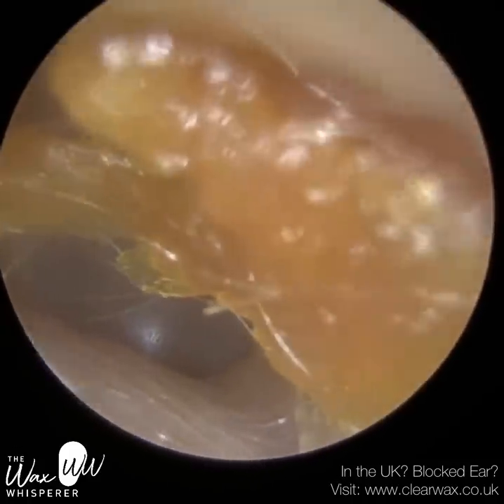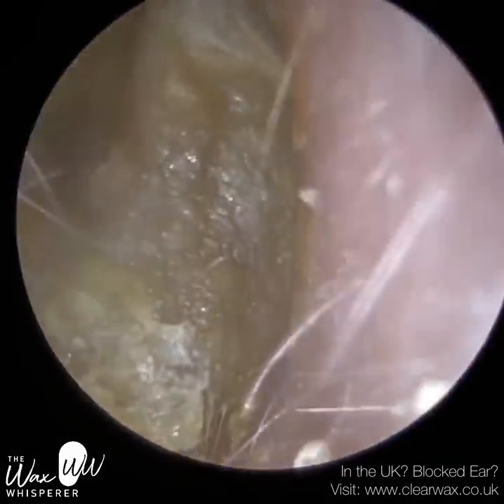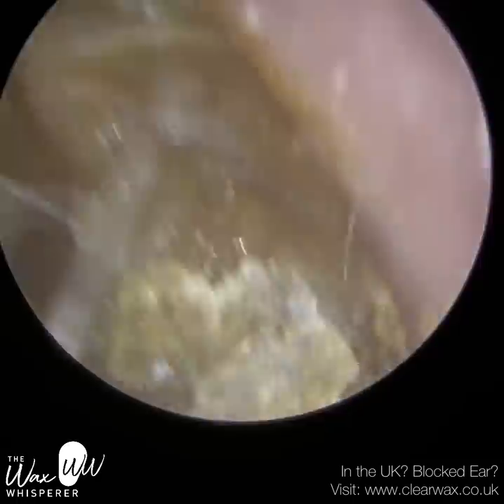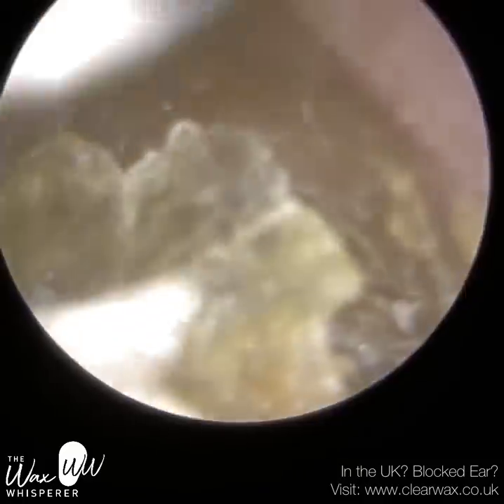This is a patient who attended reporting a blocked right ear. The ear we just examined was their left ear, so there was a bit of dead skin, a bit of dead keratin there, which we'll remove after we've completed their right ear. So this is their right ear — this is the one that was causing the mischief, and you can see it's fully blocked.